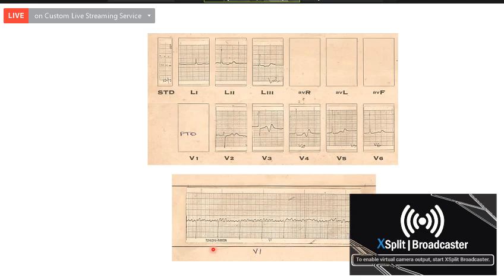At what level will you consider that the U wave is abnormal? More than 25% of the T wave. More than 50%. When the U wave is more than 50% the size of the T wave, you can definitely say that it is an abnormal U wave. So here this patient is having an abnormal U wave. What is the condition in which you can get a prominent U wave? Hypokalemia. Hypokalemia is the commonest condition where you can get a prominent U wave. So this patient is having a prominent U wave.